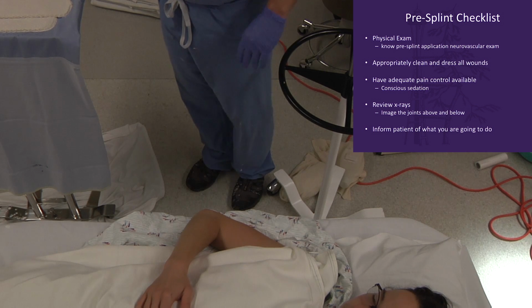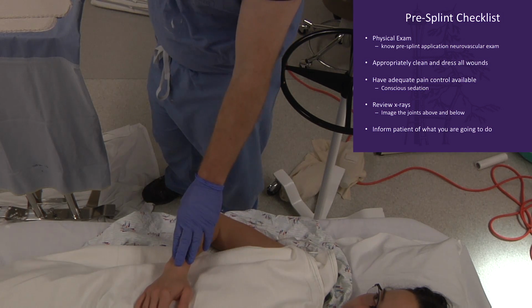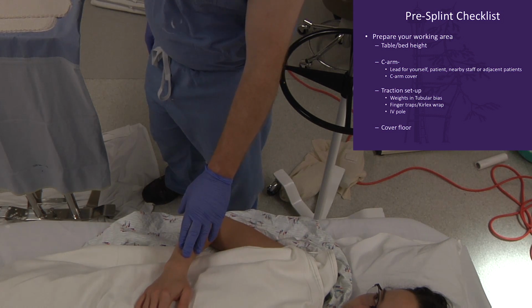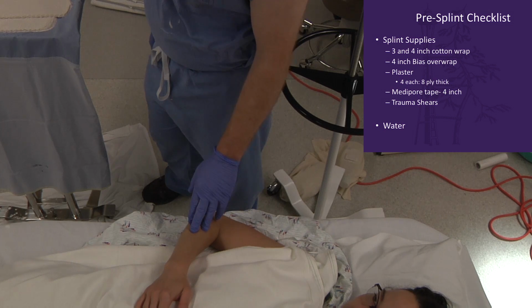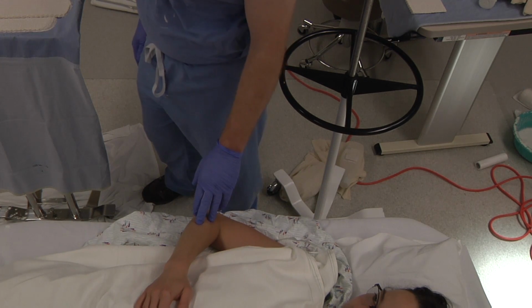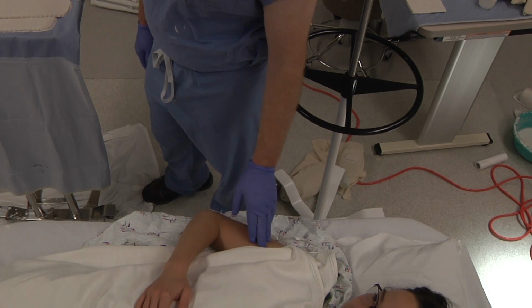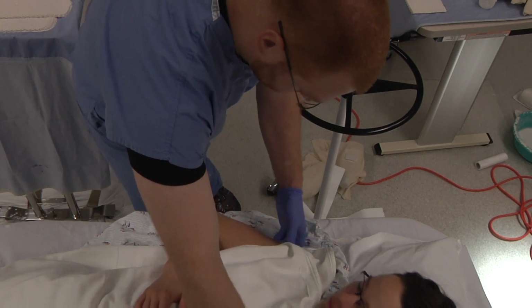We're going to be applying a long arm splint, typically in both bone forearm fractures, distal radius fractures where you need rotational control. As before, as we discussed, always make sure you have a neurovascular exam, you have all your adequate supplies, and you have reviewed your x-rays, evaluated for your deforming forces on the fracture fragments. And if you need a C-arm to evaluate your fracture, you have that readily available with lead for yourself or the patient. First thing that makes this simpler is if the patient is able, have them scoot to the side of the bed.